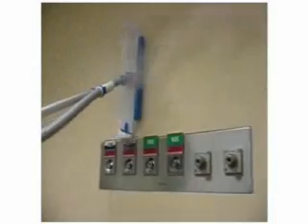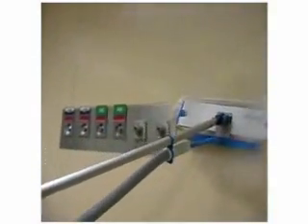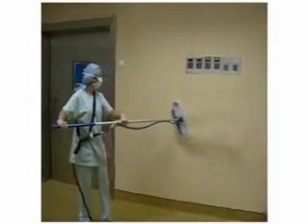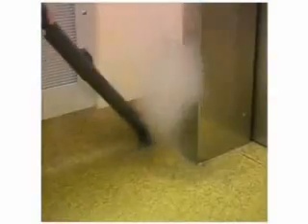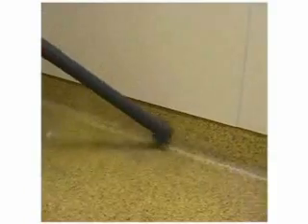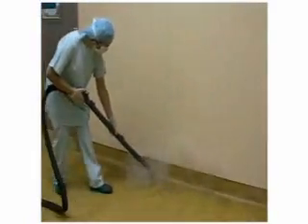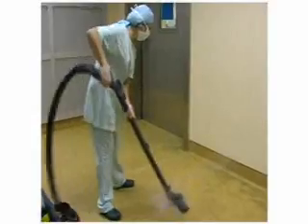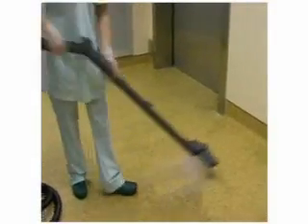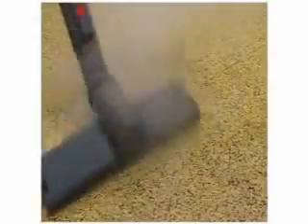In the final step of the cleaning process, the floor is cleaned and sanitized with steam, then vacuum cleaned to suck up impurities. As seen earlier, this process is carried out with a steam generator equipped with a steam brush and coupled with a vacuum cleaner. This equipment first steams the floor and simultaneously sucks up impurities. The operating theatre is then re-equipped with all the necessary medical devices.